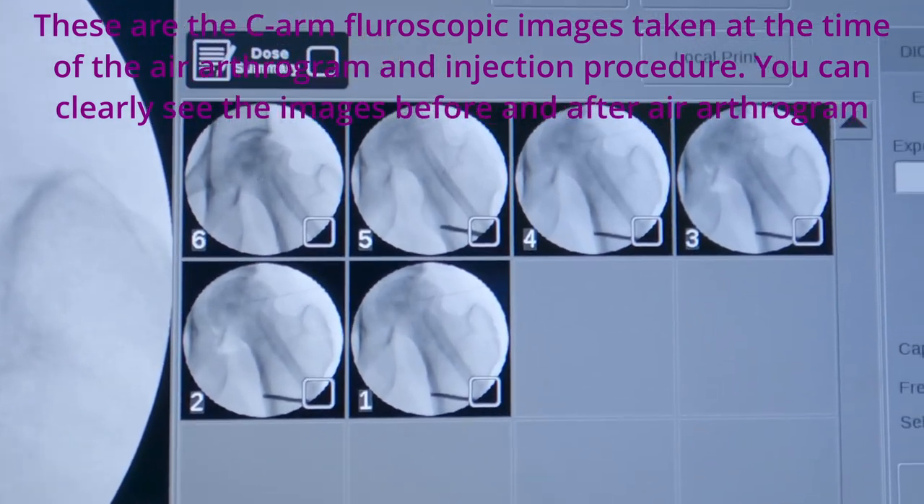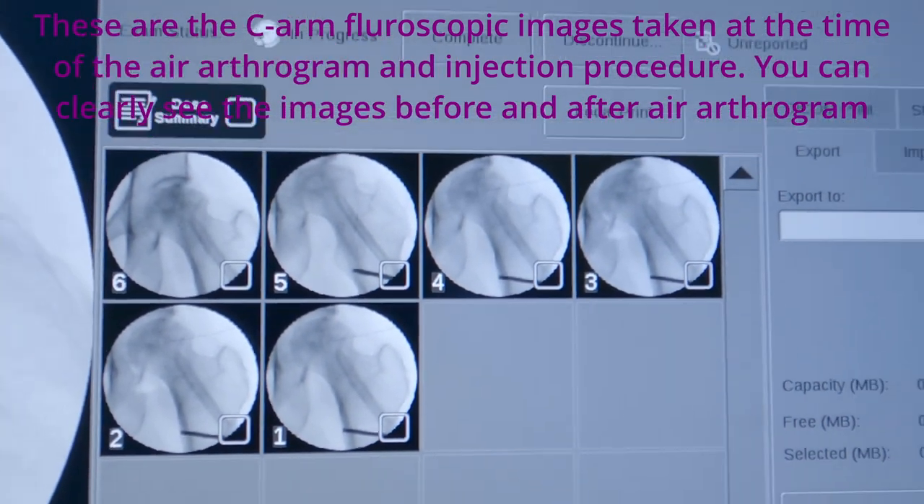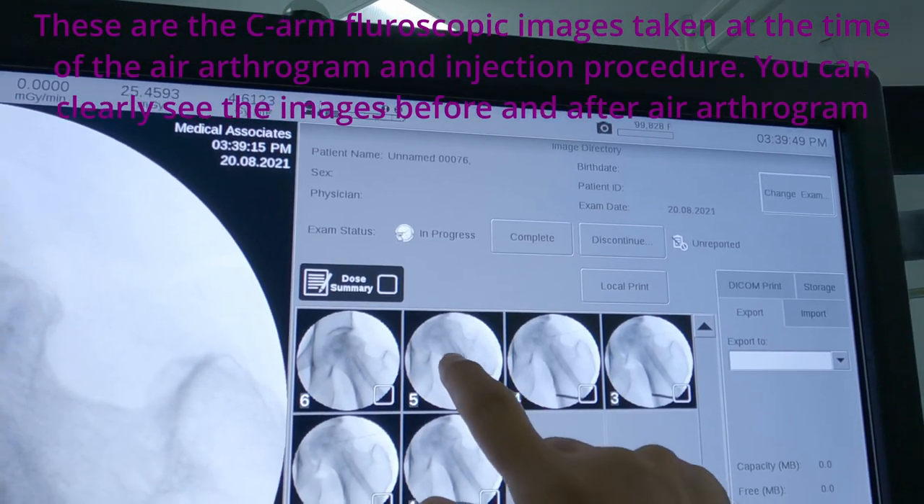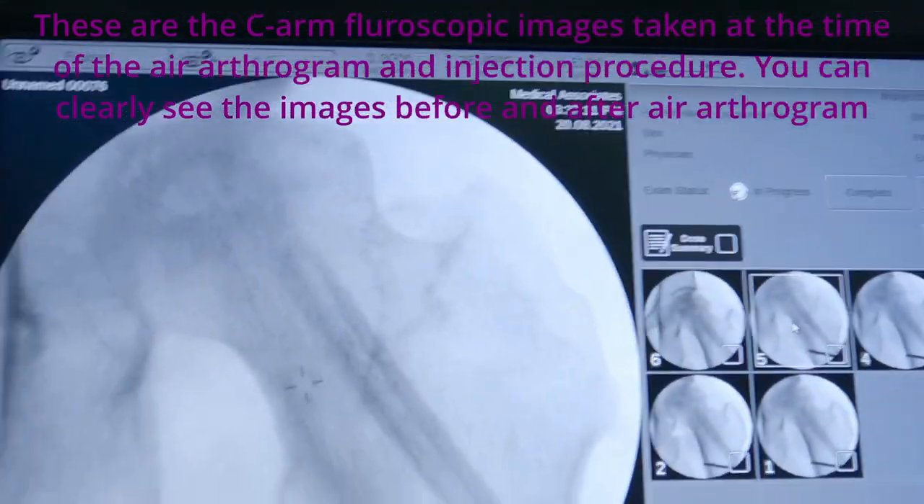These are the C-arm fluoroscopic images taken at the time of the air arthrogram and injection procedure. You can clearly see the images before and after the air arthrogram.